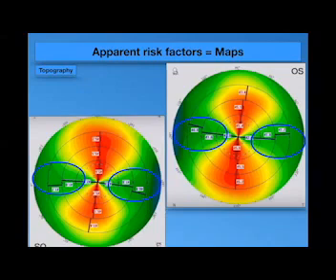If the superior point is higher than the same inferior point, but up to 2.5, it could be accepted because of the superior corneal pathology, which is endemic in Egypt, which is the trachoma and post-trachomatous pannus and subepithelial fibrosis and the vascularization, which is common in the Egyptian patients. So we can accept a difference of up to 2.5.